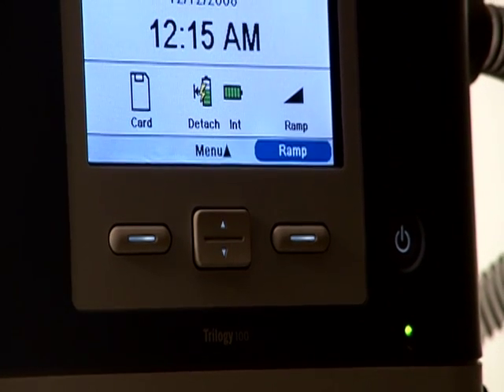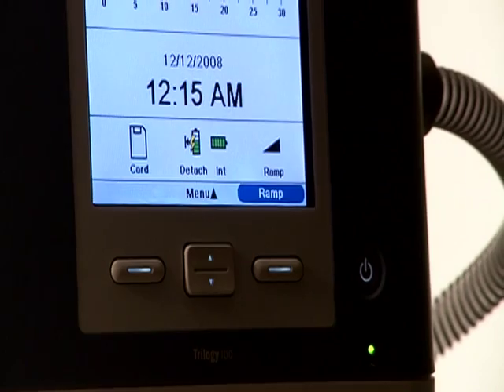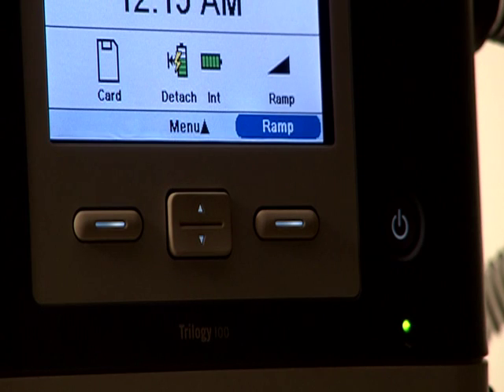To make the unit easy to use in a darkened room, the Start, Stop, Left, Right, and Up-Down keys have LED backlights. You can turn these lights off if they interfere with the patient's sleep. Here in the bottom corner is a small green LED light. When this is lit, you know that Trilogy is hooked into an active AC power source.